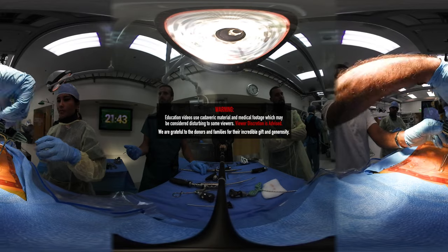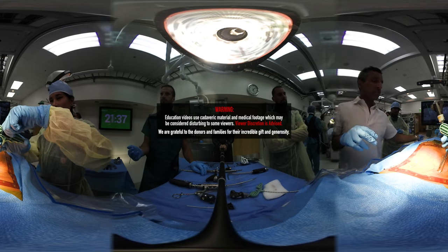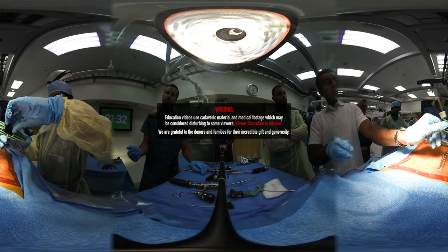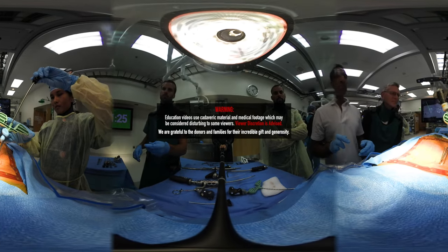So now we're going to pass our guide wire. You can pull this thing out — you're going to twist it and pull it out, just the black. Hold this, get rid of that. Hold the green steady, turn the black. There you go. Just twist and then pull out. Now you're going to take your guide wire — it's really sharp at the end, so be careful.